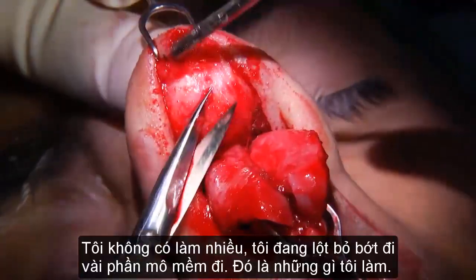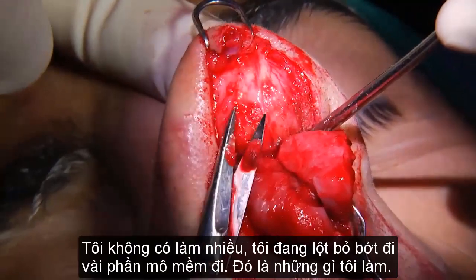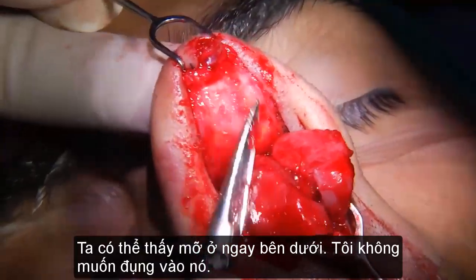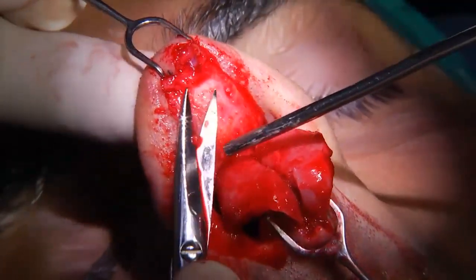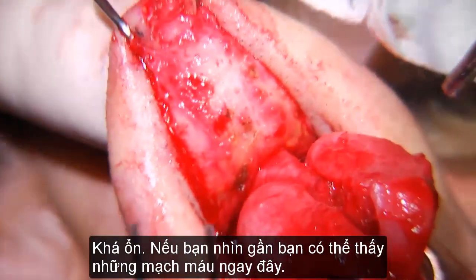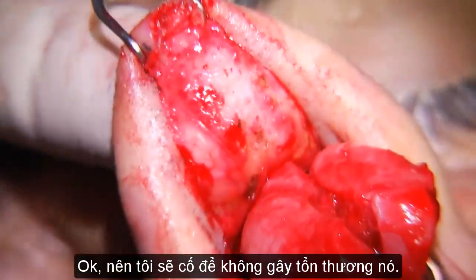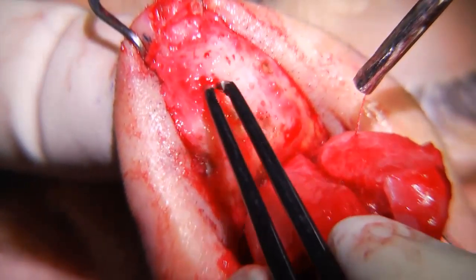So I'm not really doing much. I'm peeling some of this tissue out. That's all I'm doing. See the fat just below it? I don't want to touch it. That's fine. If you really come close, you see the vessel here. Okay. So I'm really not causing any injury.